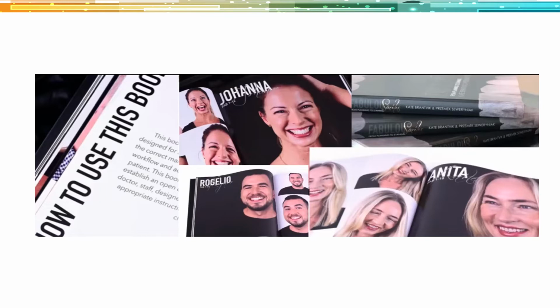But if you have a beginner lab technician or an average lab technician, they may only really do one style. And if you've ever noticed why every case maybe starts to look the same when you use a certain laboratory, that's kind of why. And so using these different libraries is a way to really customize every case that you do in a really predictable and easy way, without having to work with maybe some of the best technicians in the country that we don't all have access to.